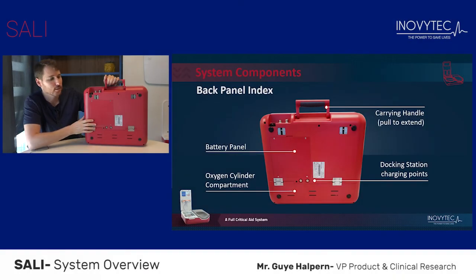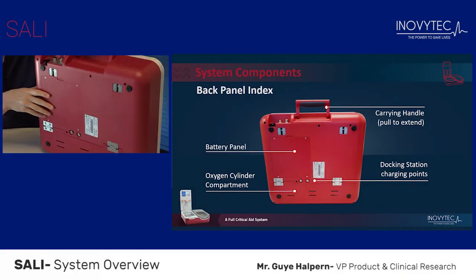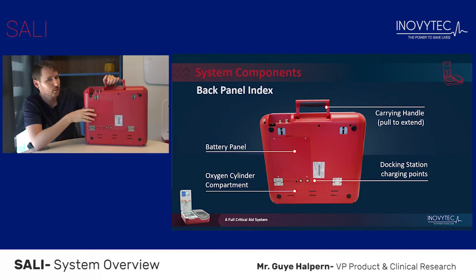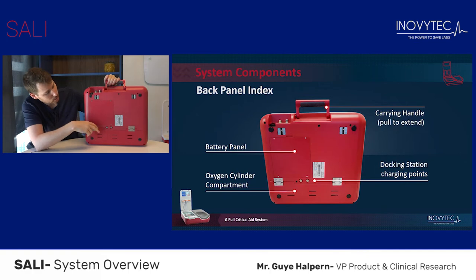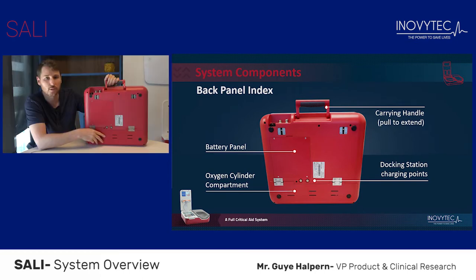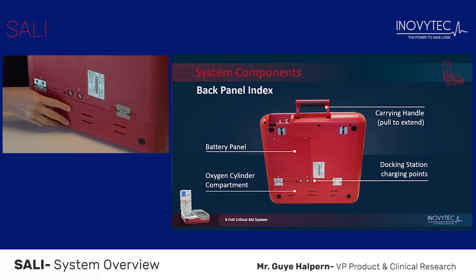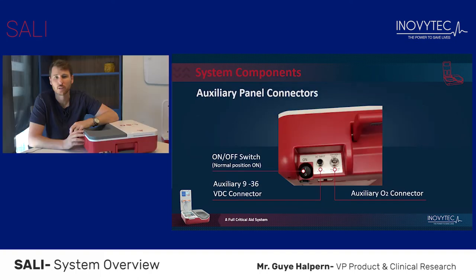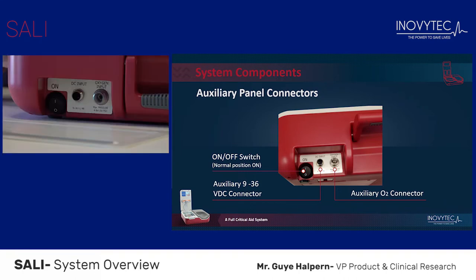The back panel is comprised of the following elements. The first is the battery panel; inside you will find the rechargeable battery. Next are the two charging points from which the SALI receives its power supply. Next is the oxygen cylinder compartment, inside which you will find the oxygen cylinder. The auxiliary panel is where you will find the on/off switch button, the auxiliary O2 connector, and the auxiliary DC connector.